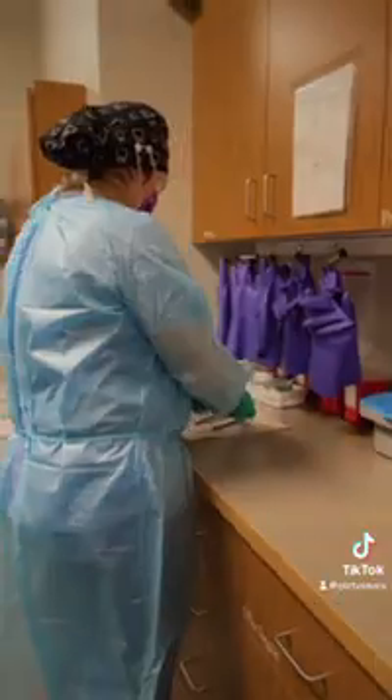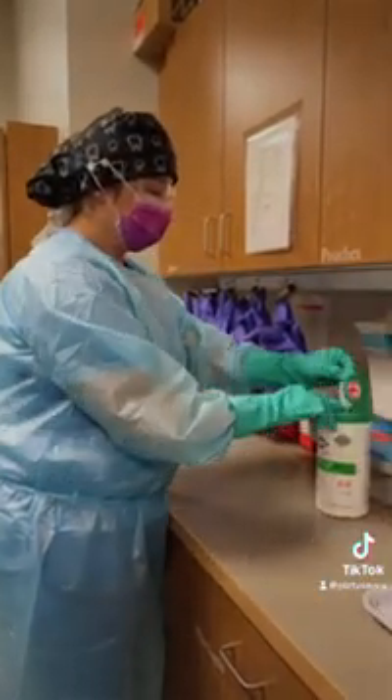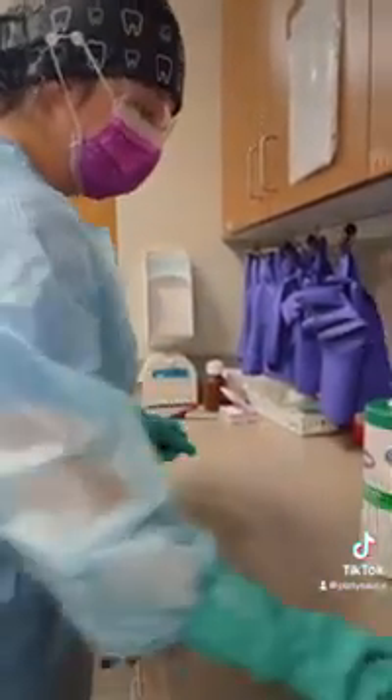We're now going to take all the sanitized instruments into the area designated for disinfection and sterilization. After those instruments have been bagged and taken care of, we are now going to disinfect the work area.